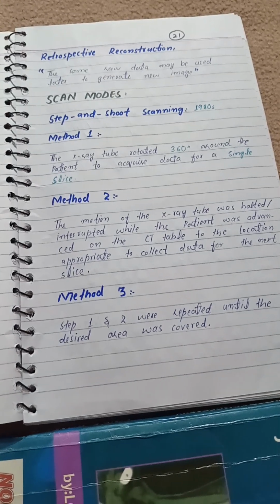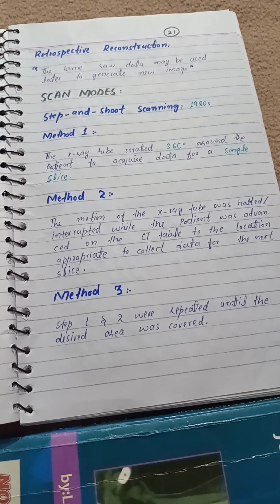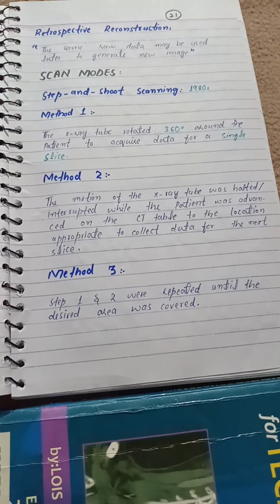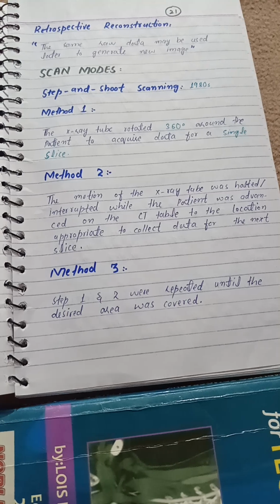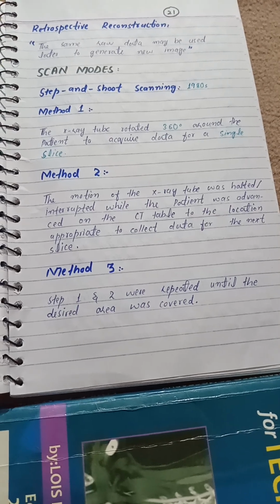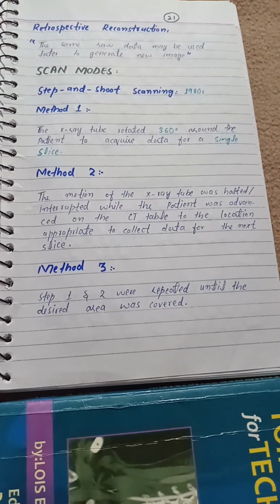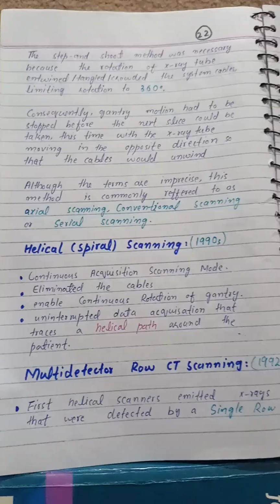Scan mode. Step and shoot scanning, 1980s. Method 1: the X-ray tube rotated 360 degrees around the patient to acquire data for a single slice. Method 2: the motion of the X-ray tube was halted while the patient was advanced on the CT table to the location appropriate to collect data for the next slice. Method 3: step 1 and step 2 were repeated until the desired area was covered.